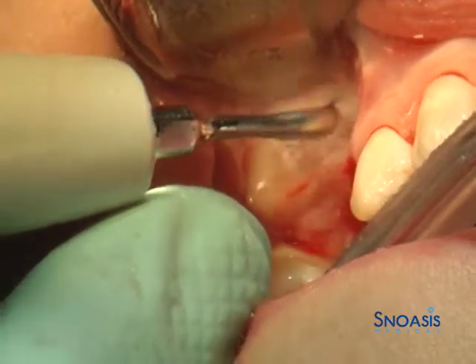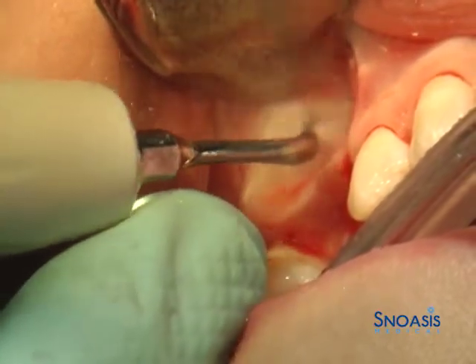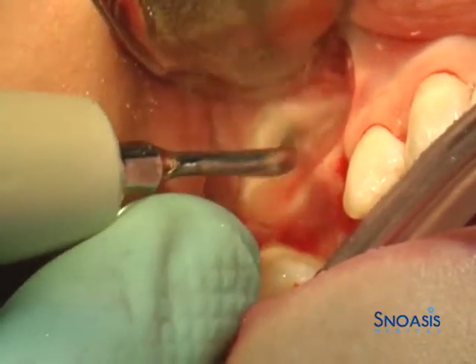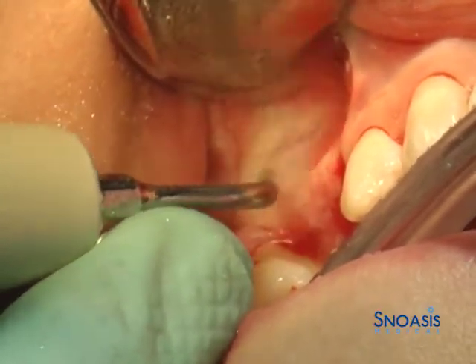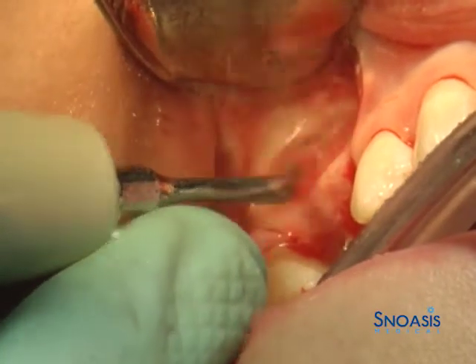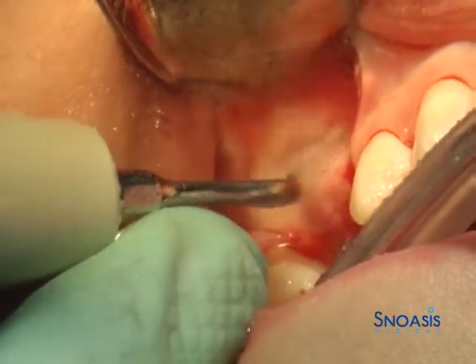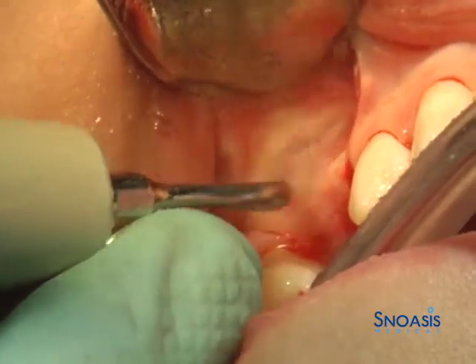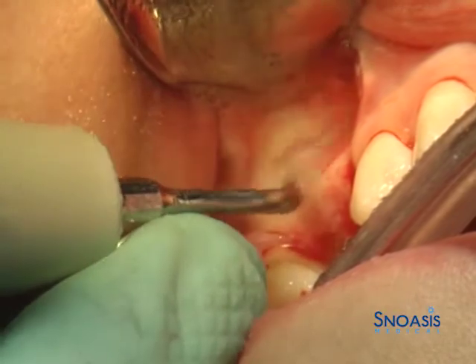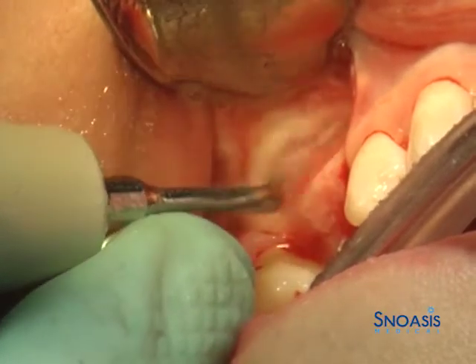The piezo-surgical handpiece is utilized with a diamond round bur to perform the final osteoplasty to the level of the Schneiderian membrane, with minimal chance for perforation given the unique qualities of the piezoelectric handpiece.